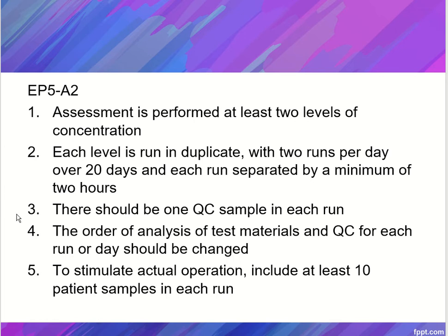There should be 1 QC sample in each run. The order of analysis of test materials and QC for each run or day should be changed, to simulate actual operation. Include at least 10 patient samples in each run.